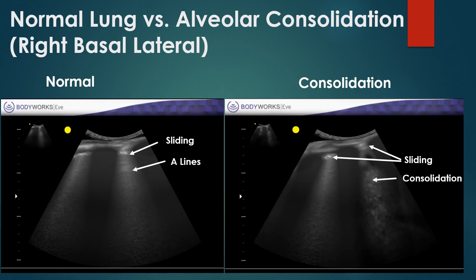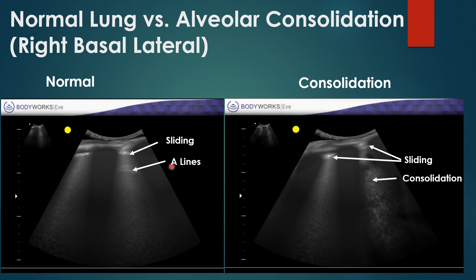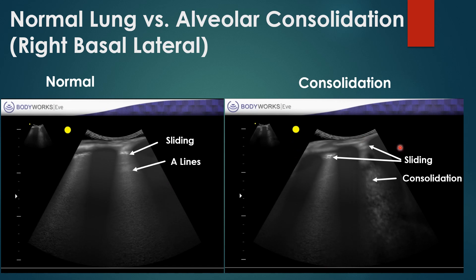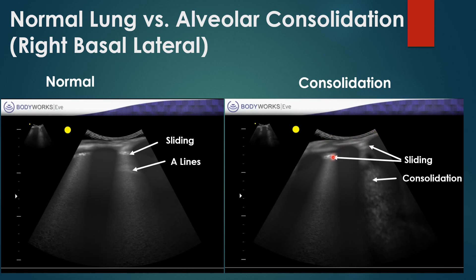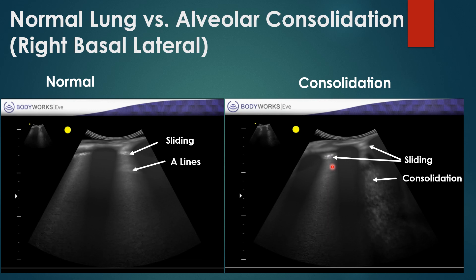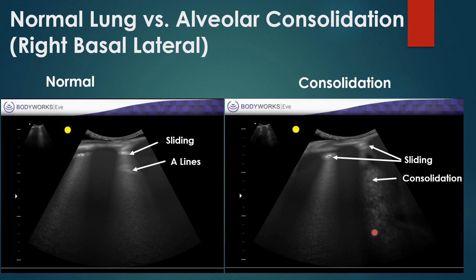Looking at normal lung versus consolidation: on the left you see the typical pattern with sliding, nice A-lines, and rib dropout shadows. On the right with consolidation, you have a curvilinear transducer at the pleural line with some sliding, but instead of a normal non-reflective A-line pattern, you have consolidation — the lung is starting to look more like an organ. Signs of pneumonia require ruling out many things including bilateral versus unilateral involvement.